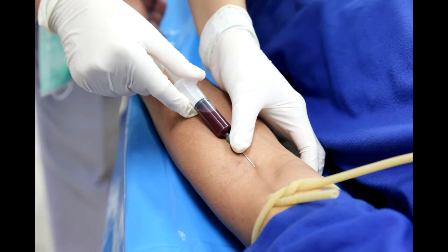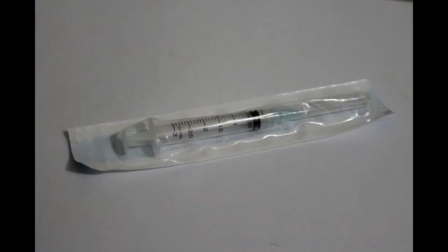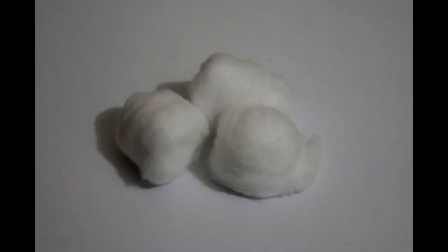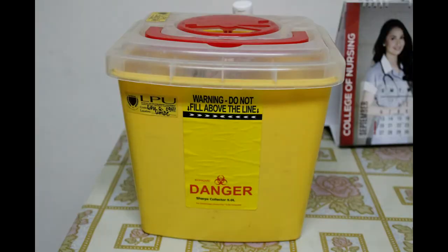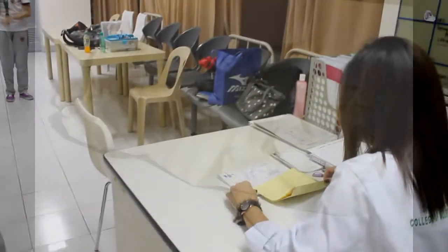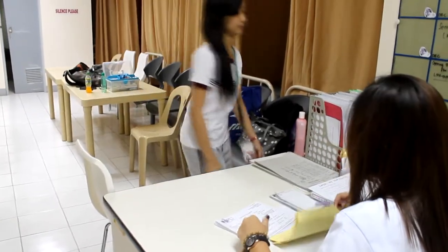successfully entered. The materials or equipment needed for venipuncture are the following: syringe, tourniquet, cotton, gauze pad, bandage or micropore tape, sharps container, 70% isopropyl alcohol or alcohol swabs, and gloves. The following is the stepwise procedure on how to perform venipuncture.